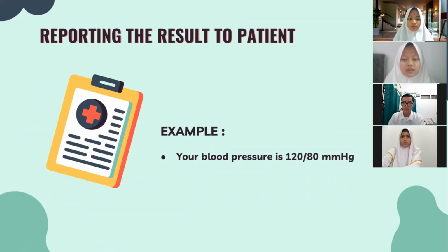Reporting the result to the patient. You can use the sentences below to report the result to the patient. For example, your blood pressure is 120/80. I have a video about how to check blood pressure carried out by a nurse. Let's watch it carefully.